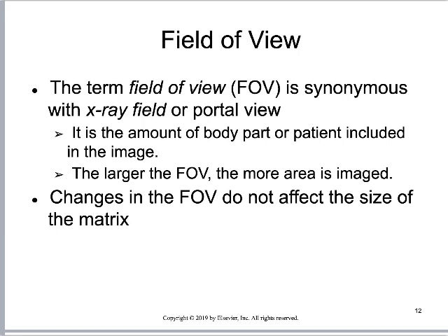To go back to Ms. Thorne's question from earlier, the only way you can change the appearance of that matrix size is to zoom in. Then it will seem that the matrix is growing, or in one case shrinking, so that the pixels get larger. All right. Yeah, this is one of my biggest things.